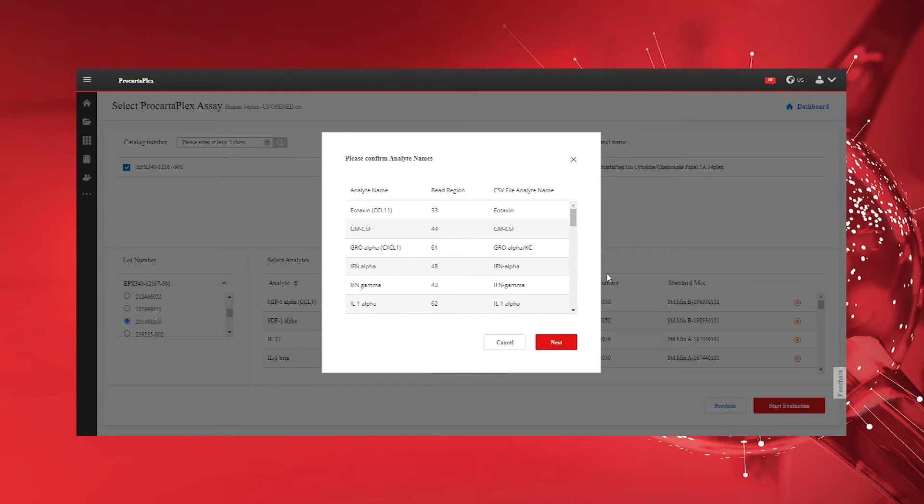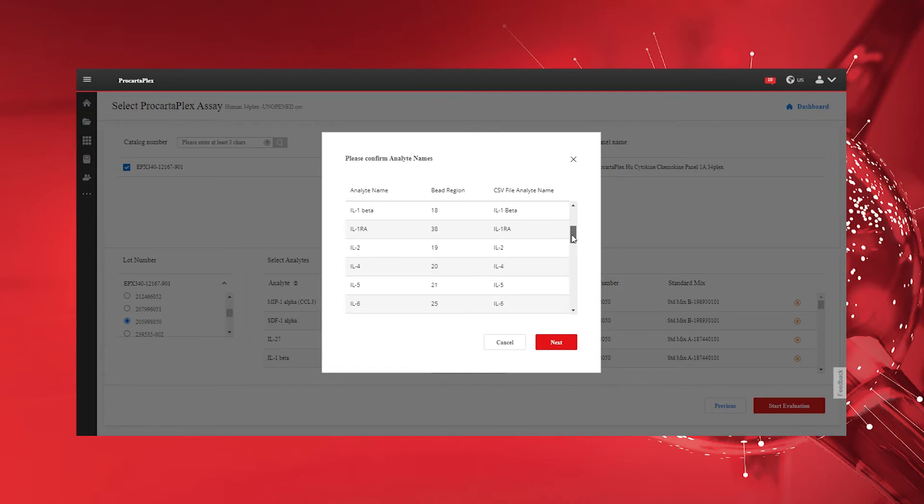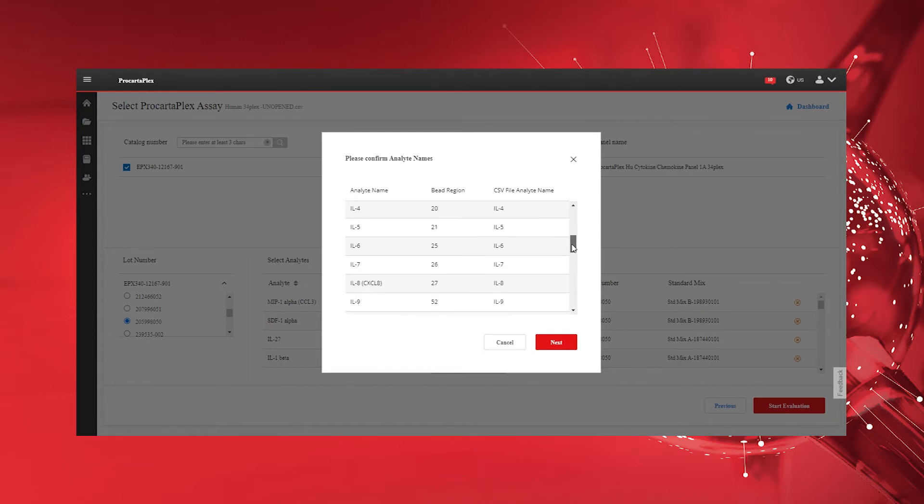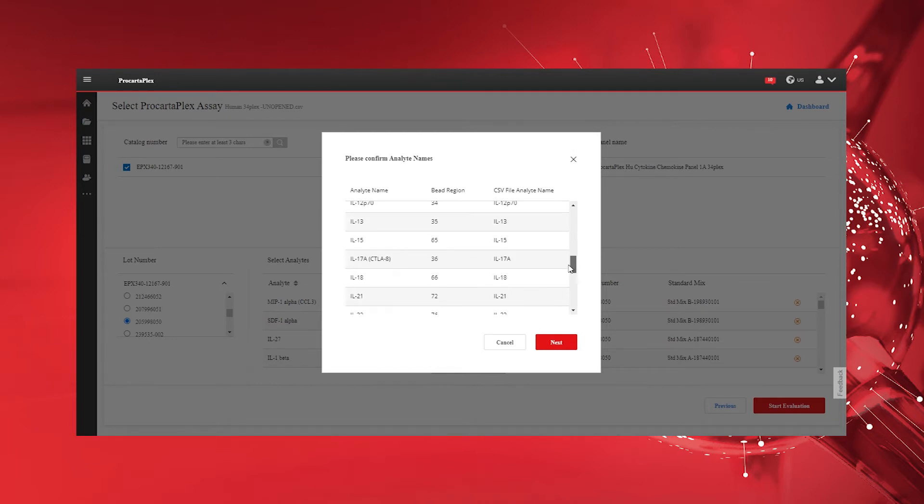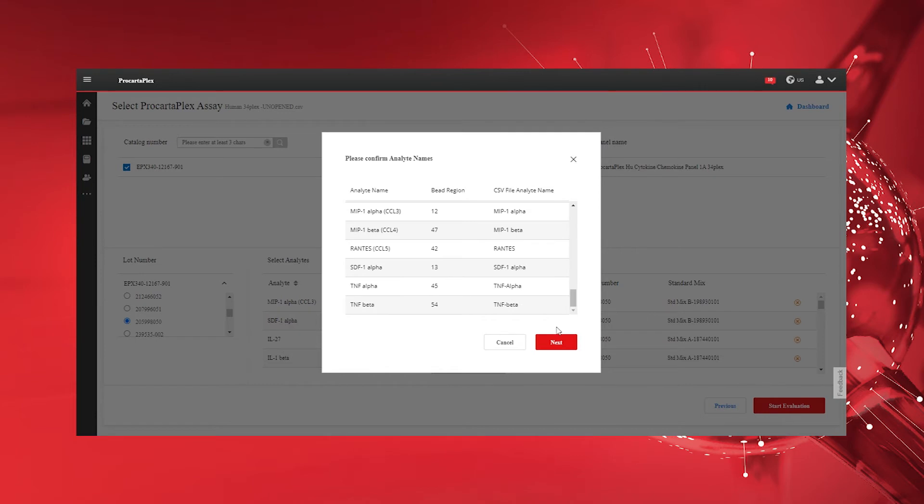Verify that your analyte selection matches the analytes listed in your CSV raw data file. A mismatch between your selection and the raw data is indicated in red. Select Next to confirm and proceed to the results page.